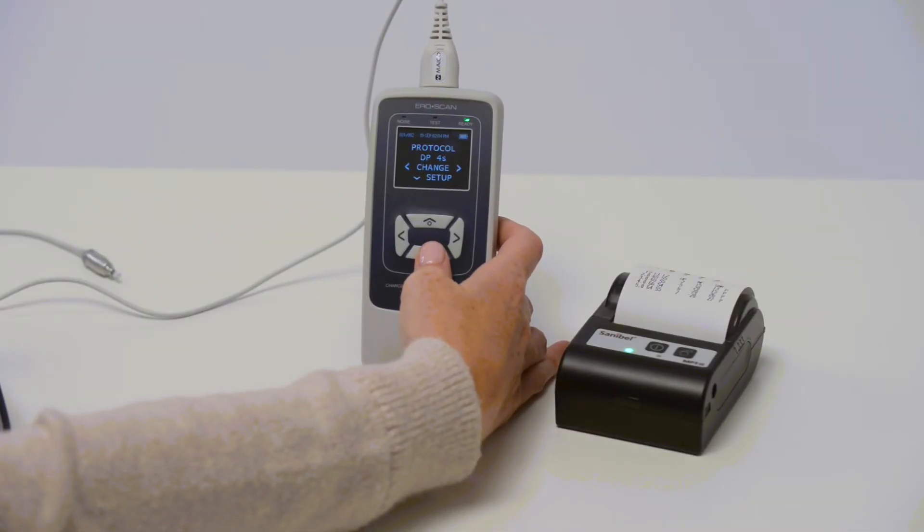There are additional settings on the device. For example, press the down arrow button three times to access the date and time.